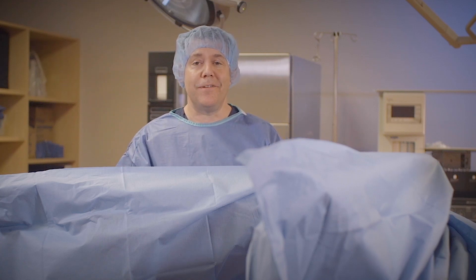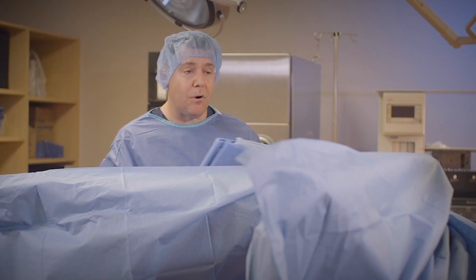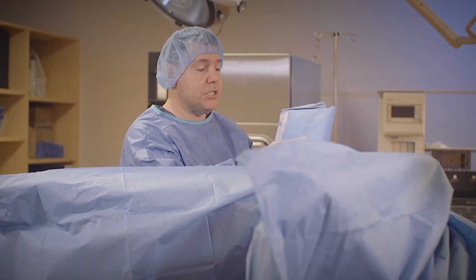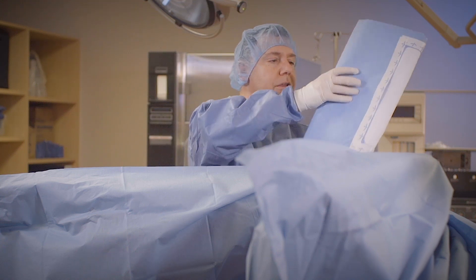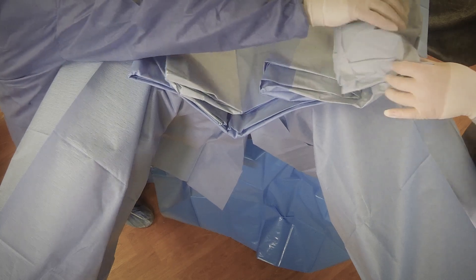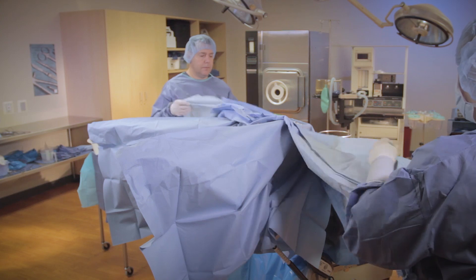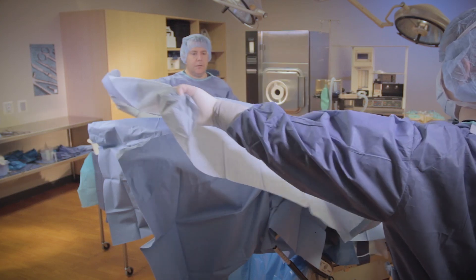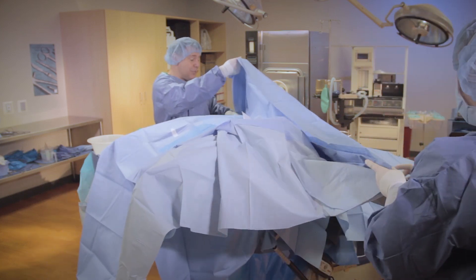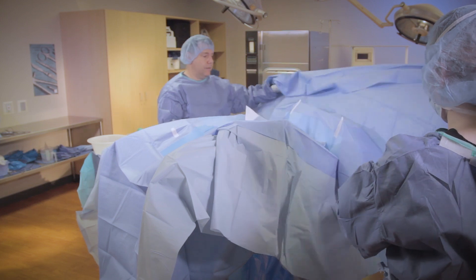And then lastly we have the fenestrated drape. I only have a laparotomy drape, but there are other drapes out there that will completely cover the patient. I'm going to put the hole right at the incision site and extend it to my surgeon. We're going to create a cuff, go down, completely extend the drape, then create a cuff and go forward.